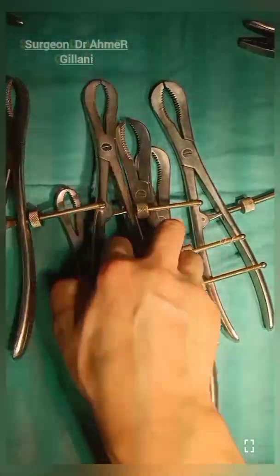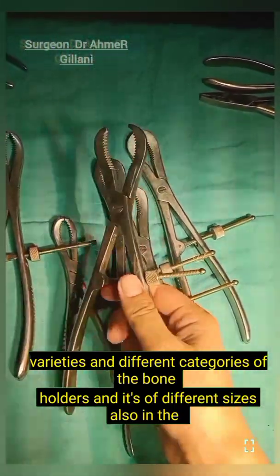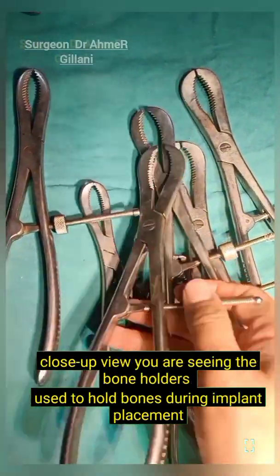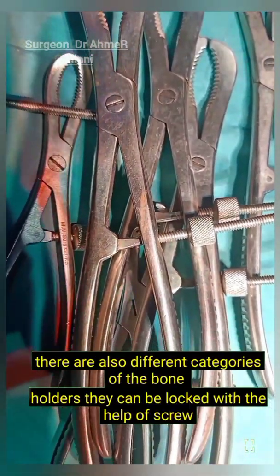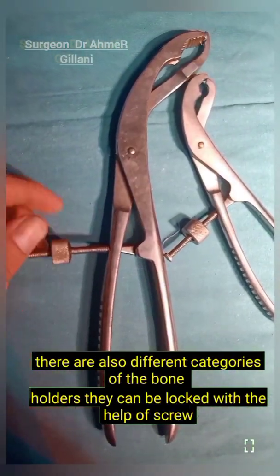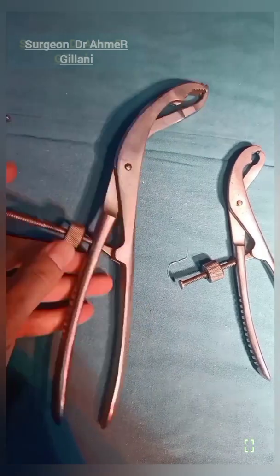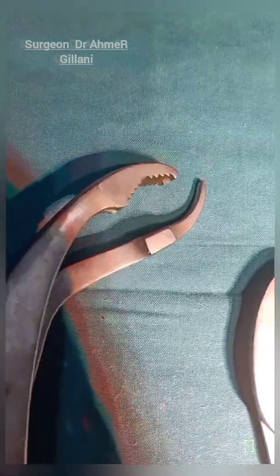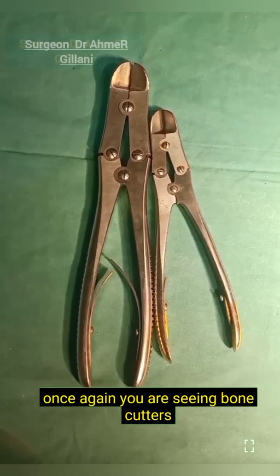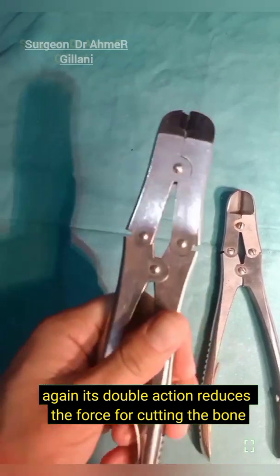In the next section you are seeing different varieties and categories of bone holders of different sizes. In close-up view you can see the bone holders used to hold bones during implant placement. There are also different categories which can be locked with the help of a screw. Once again you are seeing bone cutters — their double action reduces the force required for cutting the bone.